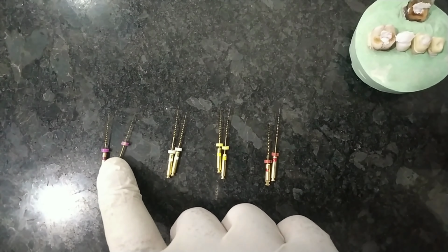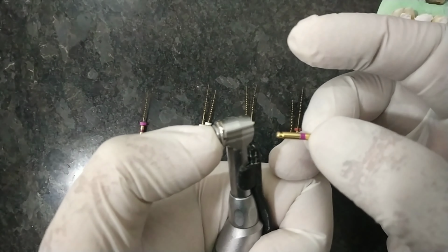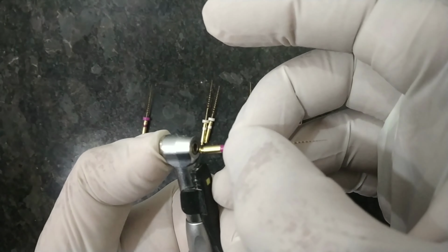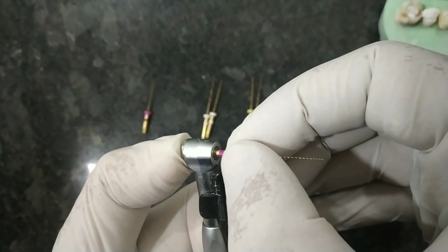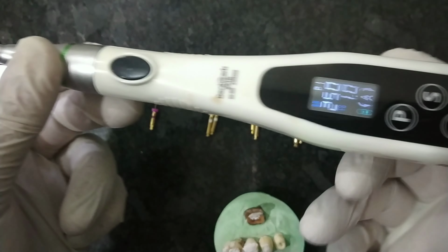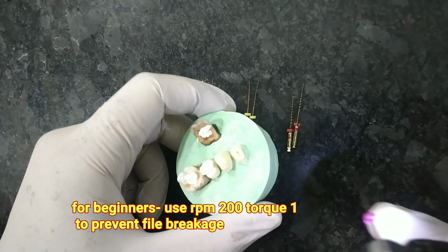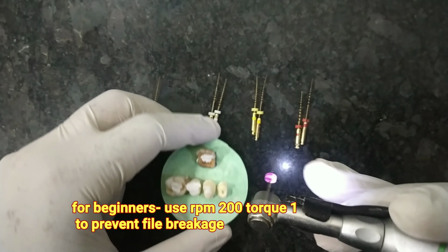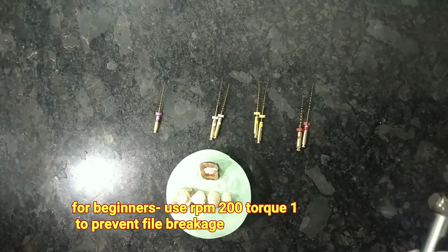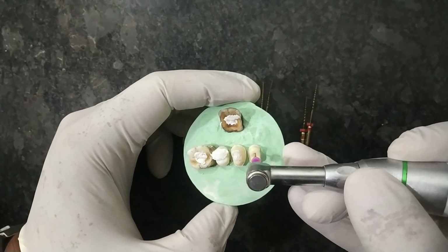I'll show you how to fit the endomotor along with this file. You just have to press this button which is on the back side of the endomotor handpiece, and you insert it like this and give a slight rotation. And it will make a small sound. Now you have to see what RPM it is. I have set it to auto reverse, 250 RPM and 1 torque. For the beginning you can do with less torque. This one I have already shown you with the files, and this LED is working nicely. I'll just remove the LED because it's too much light. You can see here how I am inserting the file like this.